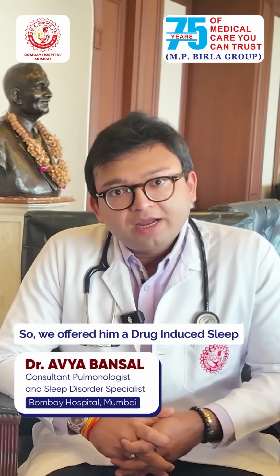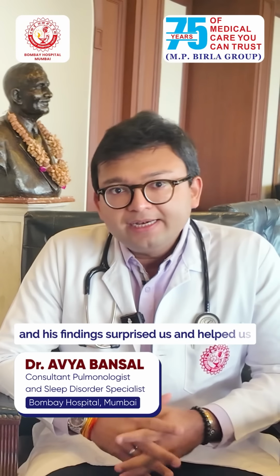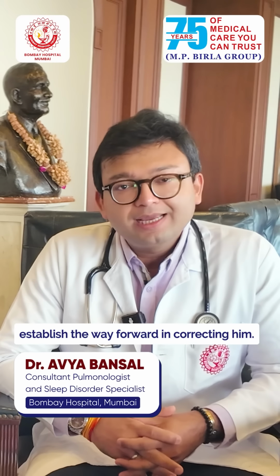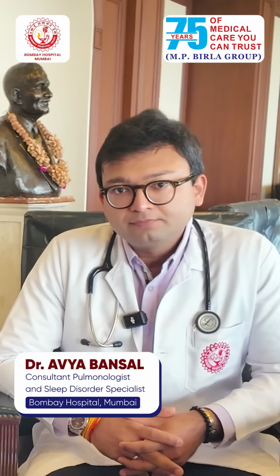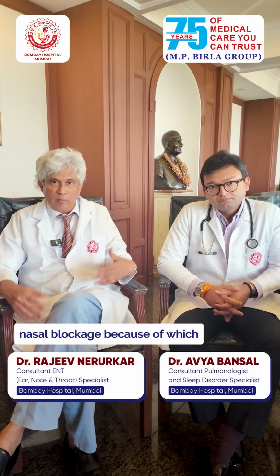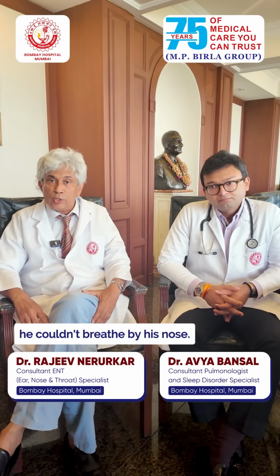So we offered him a drug-induced sleep endoscopy after getting a scan of the upper airways, sinuses, and the neck. And his findings surprised us and helped us establish the way forward in correcting him. So when we did DISE for this patient, I realized that he's got palatal obstruction, which is what we say talu. He had nasal obstruction, nasal blockage, because of which he couldn't breathe by his nose. He had problems at his tonsillar levels, and which is what was compressing his oral cavity while breathing and sleeping.